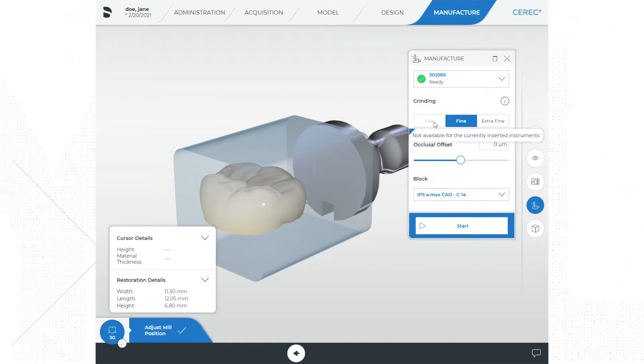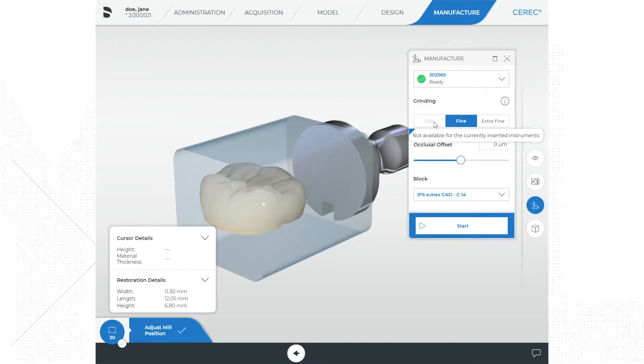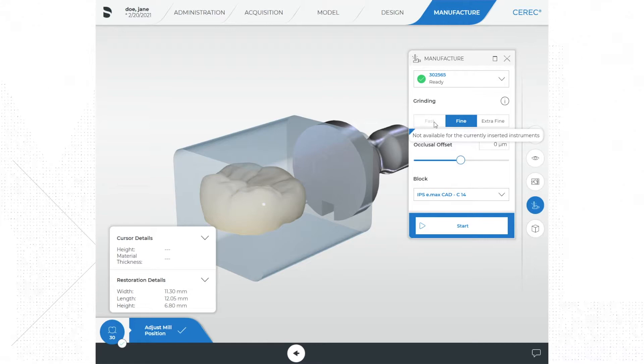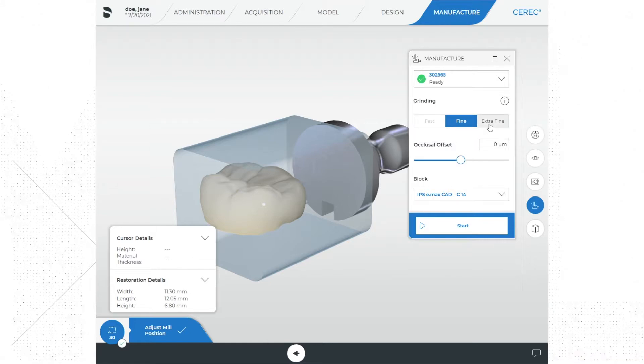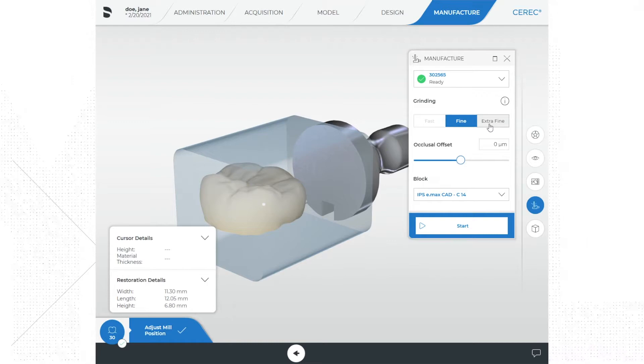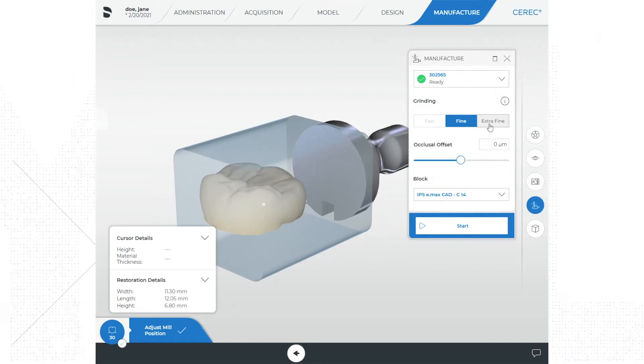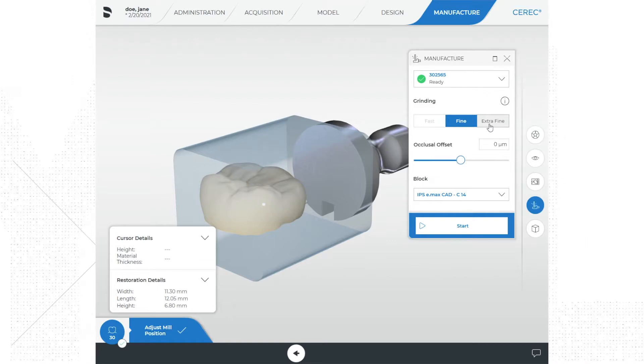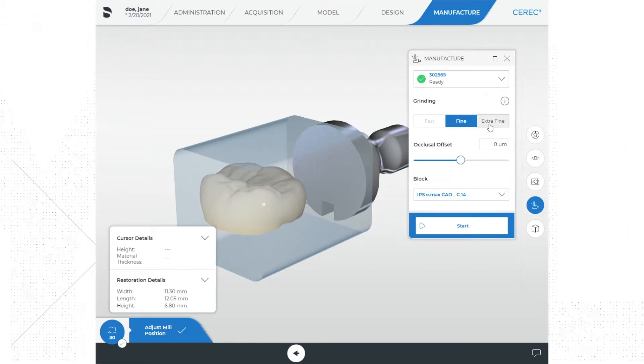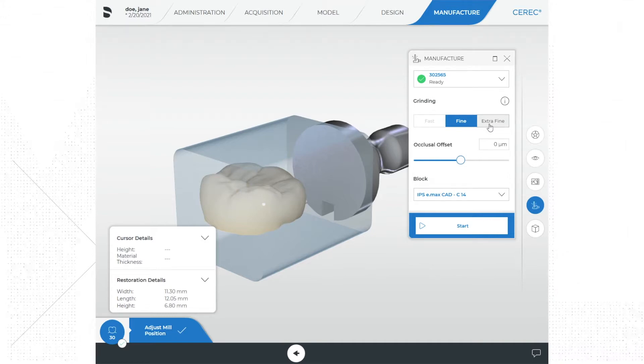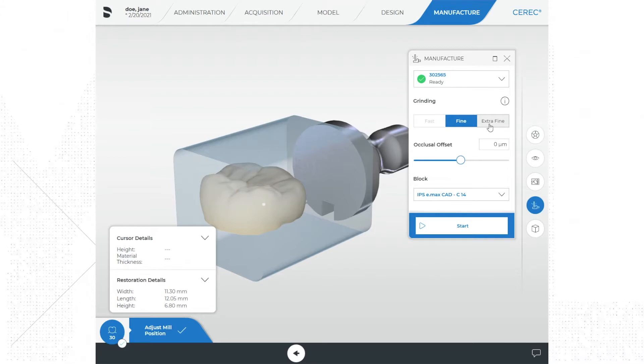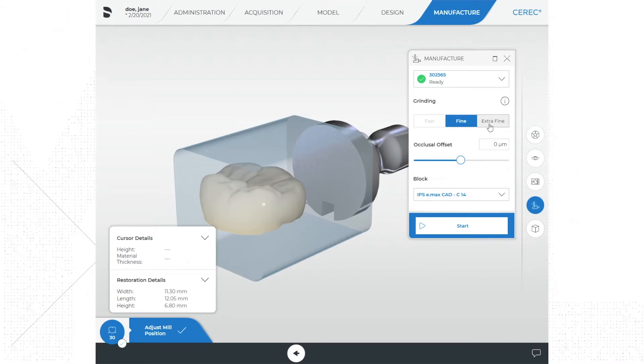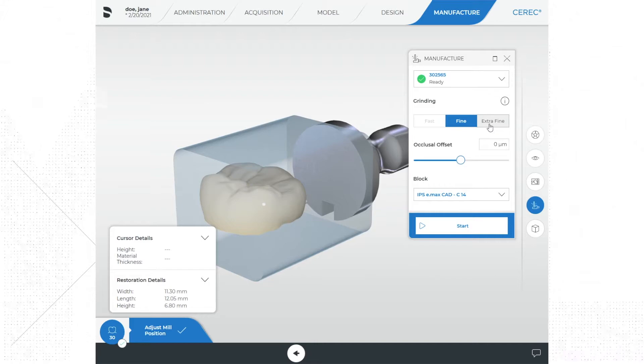The extra fine option is only available within the milling units that have four motors. This option uses both normal and extra fine grinding burrs in two separate processing steps and can provide deeper fissures, smoother occlusal surfaces, added stability on irregular margins, and very detailed embrasures on bridges. The machining times are double those with fine mode.